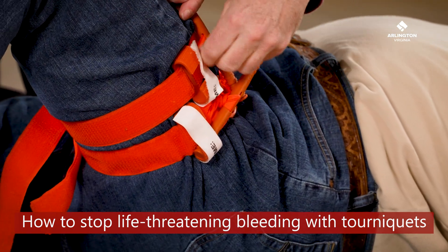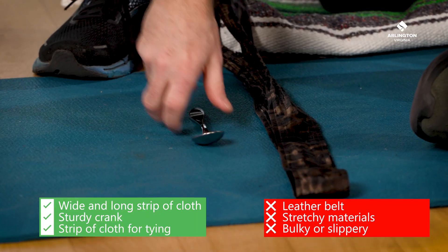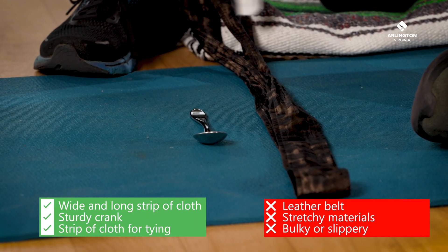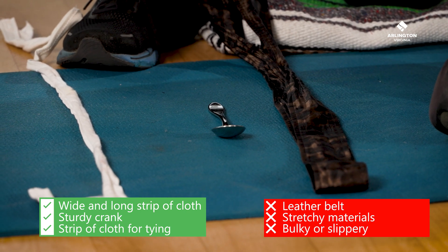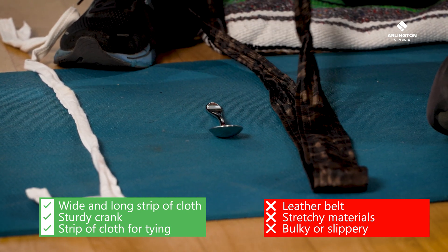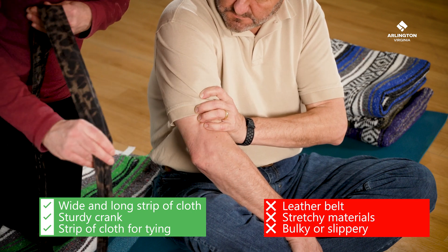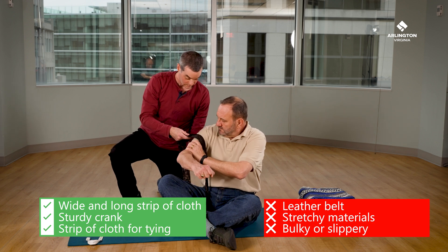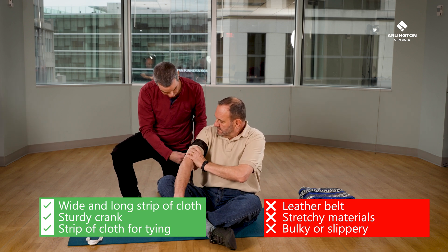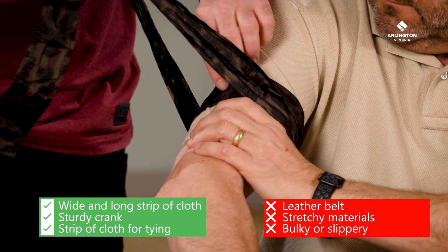If you don't have a commercial tourniquet, you can improvise one. To improvise a tourniquet you need three things: a long strip of cloth a few inches wide, a sturdy crank that won't break, and a strip of cloth to tie down the crank. The long strip of cloth will serve as a strap — it needs to be wide enough that it doesn't rope into a tight string, which is less effective and can damage nerves. It must be long enough to wrap around an arm or leg several times, and it needs to be twistable.